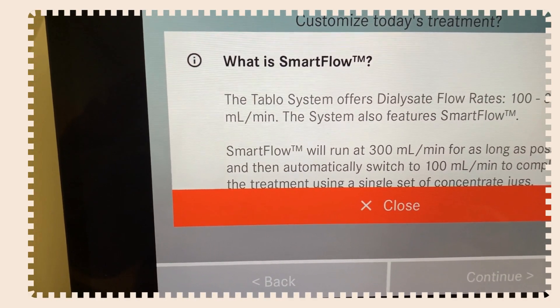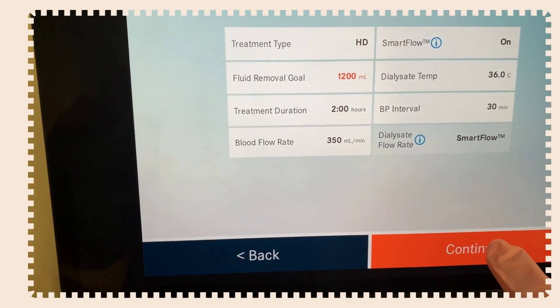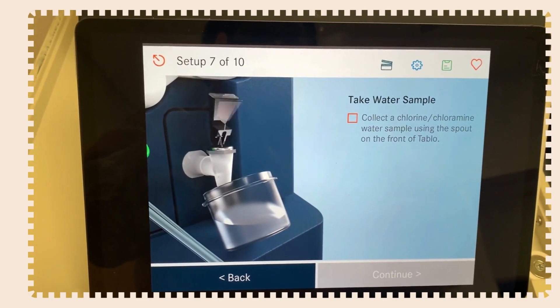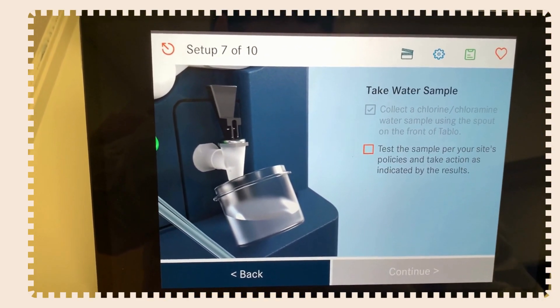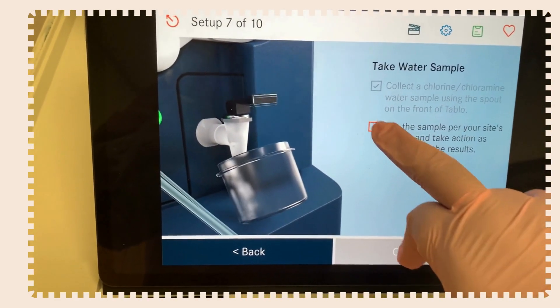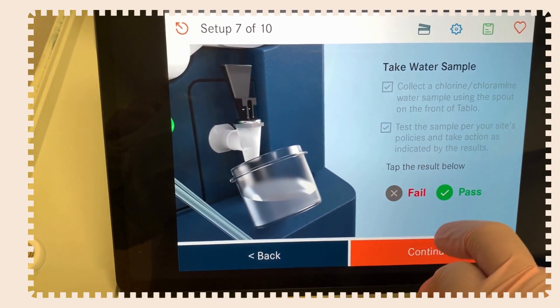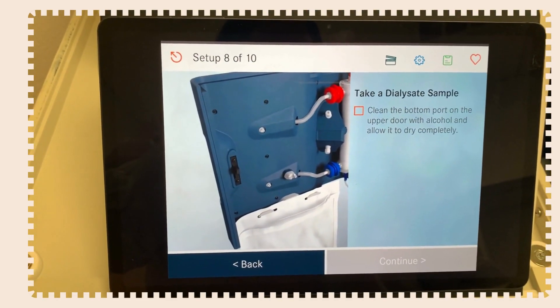Now let's take our water sample. Collect a chlorine/chloramine water sample using the spout on the front of the Tableau. Test the sample per clinic policies and take action indicated by the results, then tap your result on the screen. You never want to hook up to the machine if the water sample failed, but you do need to report the result to the machine.